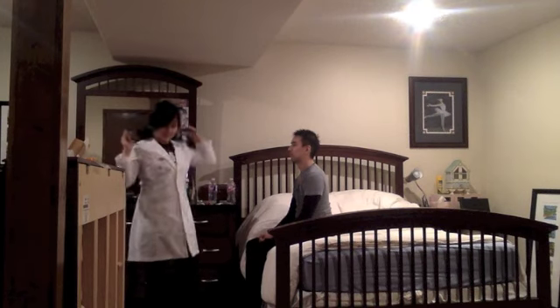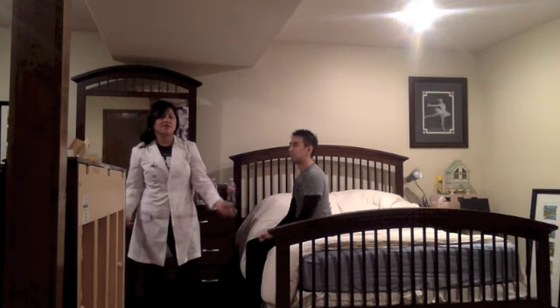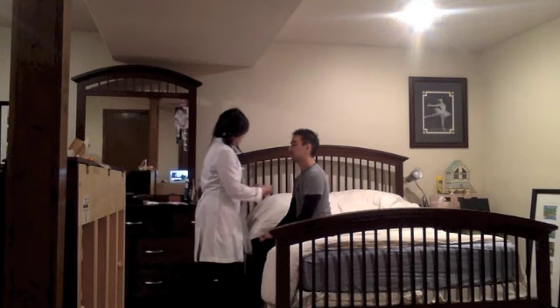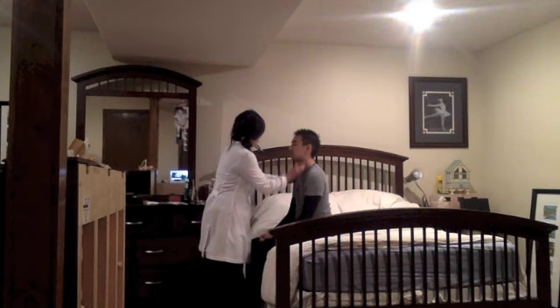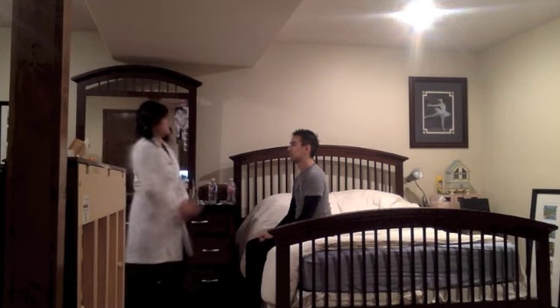I'm going to take the bell of my stethoscope to listen to his carotid artery and also his thyroid for bruits. Okay, no bruits heard. We'll move down to Jordan's upper extremities.